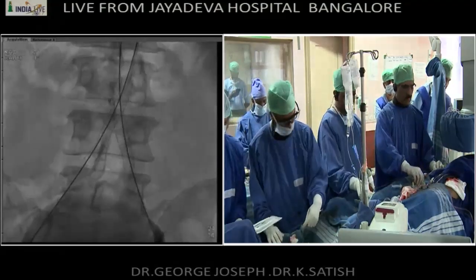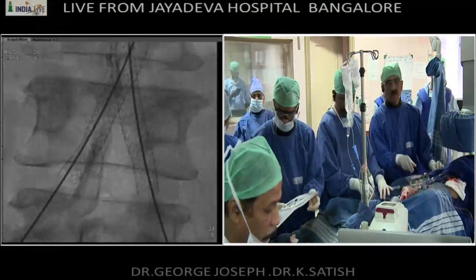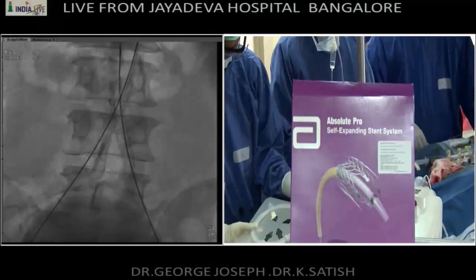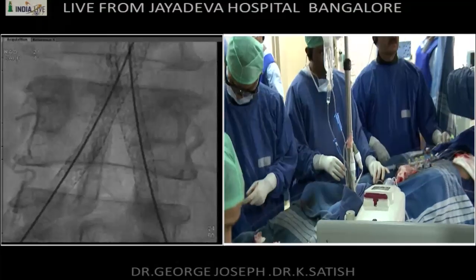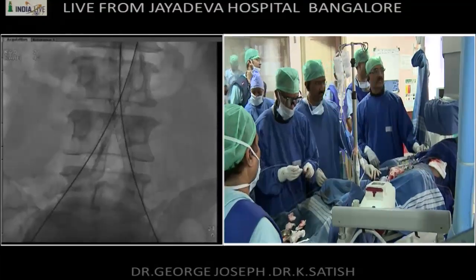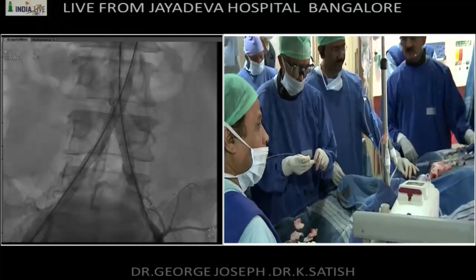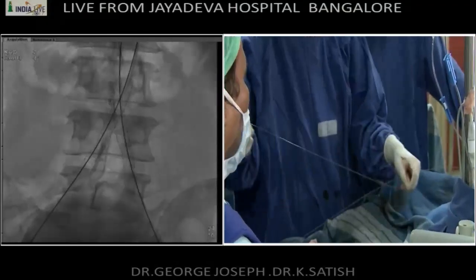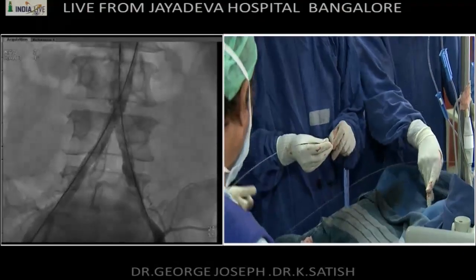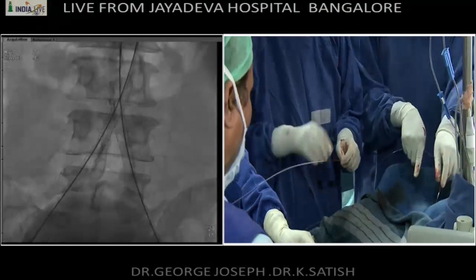After that, do you want to do a proximal optimization of these stents in the aorta? Because there is a space between the two stents. So there is a gap there. We could think about that, but I'll just finish this right now. Just give a flush because I'm not getting a pressure through this line.